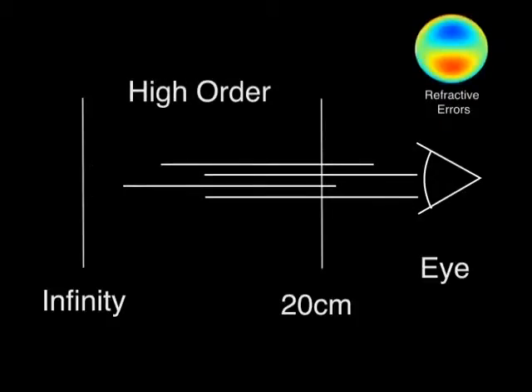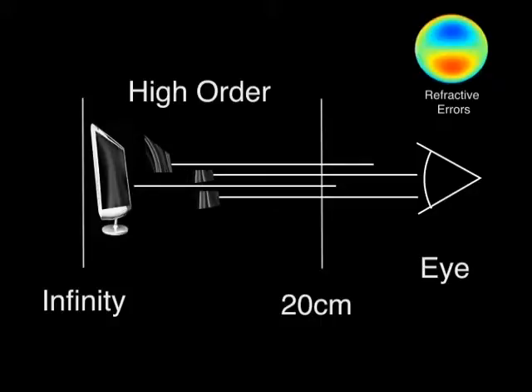An eye with higher order aberrations, such as coma or keratoconus, has a different focal range for each position on the cornea. Our tailoring process divides an object into pieces and places them at several depths. Each piece emits light for a specific section of the eye. These split light fields are then naturally integrated into the retina. Since we are using multiple depths for each focusing plane, we say our device is not only multi-focus, but also multi-depth.